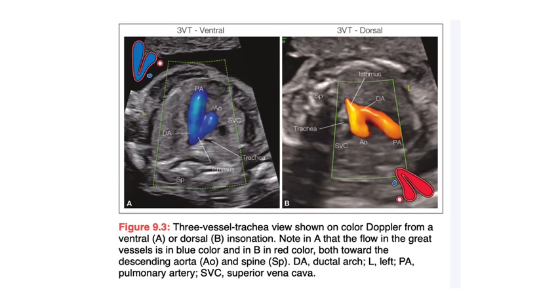Over on the right, they're moving towards the transducer, so they're both red. Now, if you happen to get this exactly perpendicular, you could get one blue, one red, if you've got the arrowhead sitting on its side like that. But for the most part, they're going to be the same color because they're going the same direction.